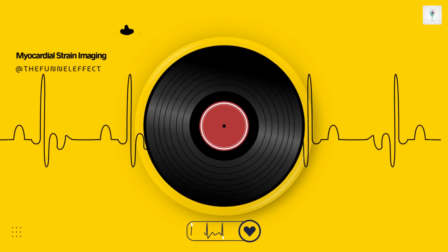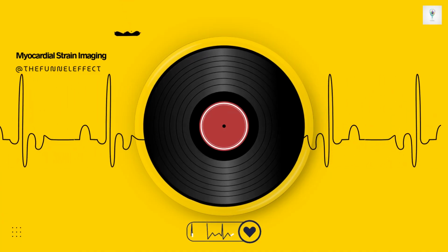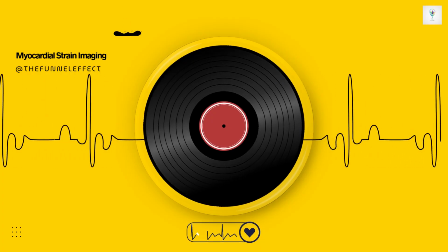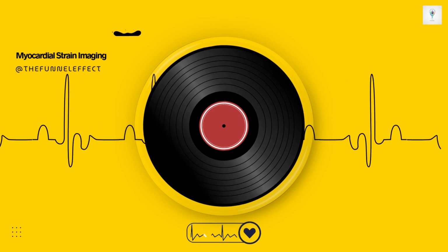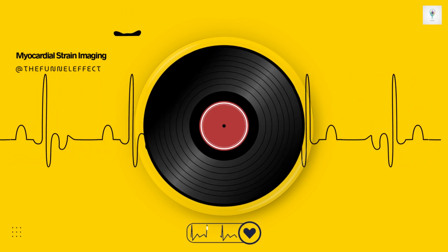If you get that wrong. Oh, it's everything. That reference point, which we call L0 or sometimes T0, is the length of the heart muscle at end diastole. The fully relaxed state. Exactly. It's the most consistent and physiologically stable baseline we can use for comparison. Contraction begins from that end diastolic position, so it's our zero point.